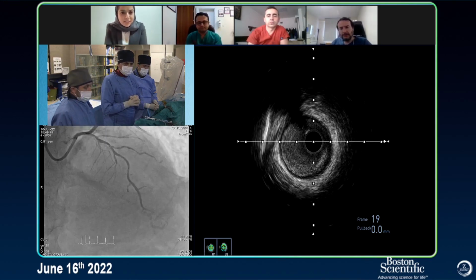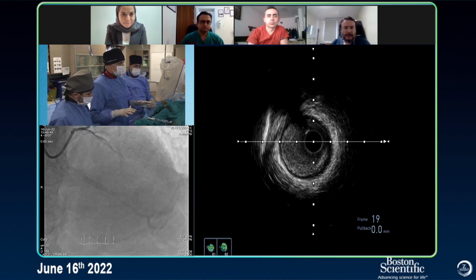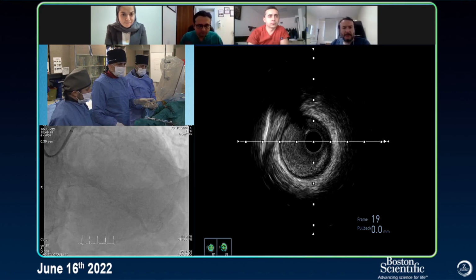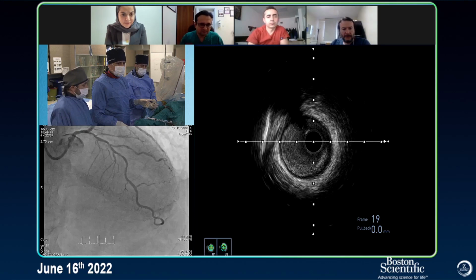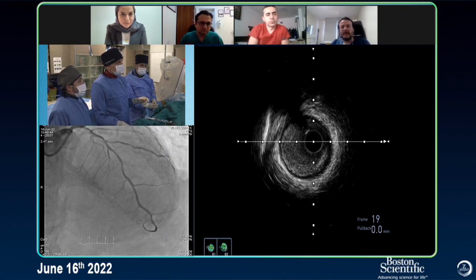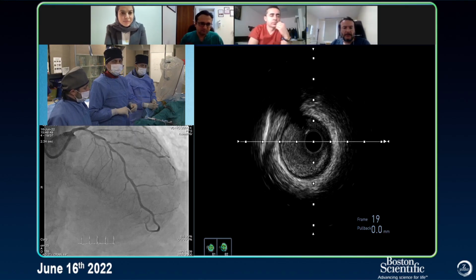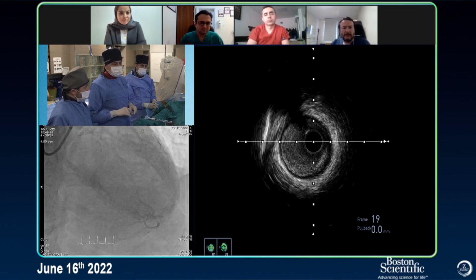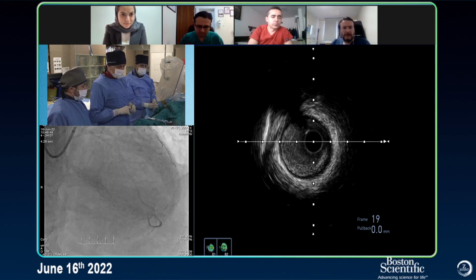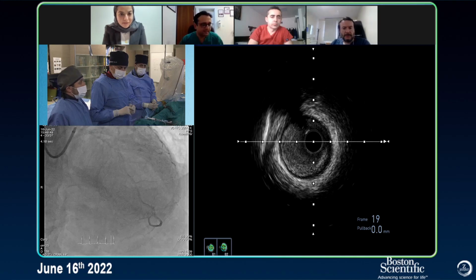Okay. You can go ahead and let us know where you're at now. Okay, yes. So here, we did IVUS and nothing more. We inserted our rota wire with the help of Mamba Flex, which is a microcatheter we use in CTO. And I use here the extra support rota wire. The reason is we have eccentric plaque here, so I thought that is much more helpful than the flop rota wire. What do you think at that point? Definitely, yeah.